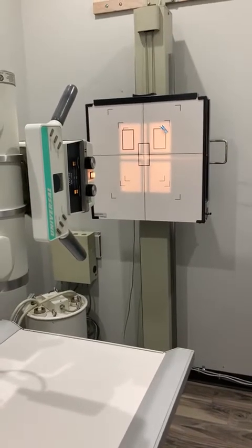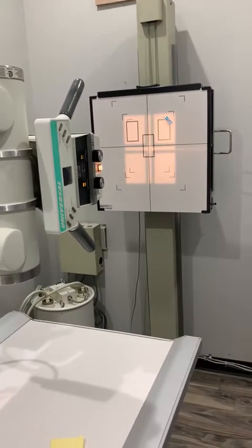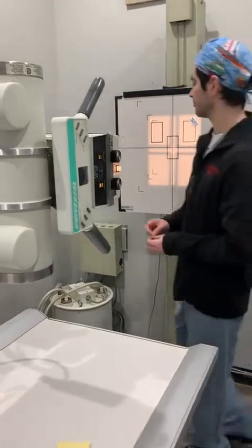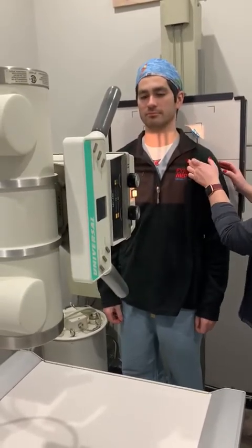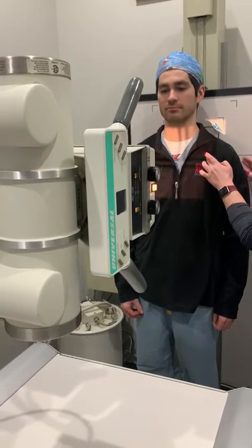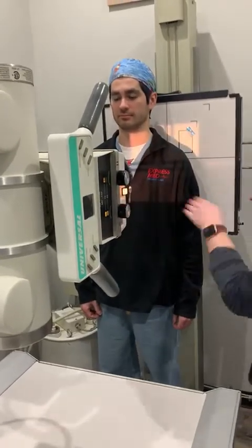We're going to do a simple shoulder X-ray. You're going to have your tube at 40 inches, perpendicular to the bucky. It's going to be a small film. You're going to have your patient with their back up against the board, right into their shoulder joint. The central point is going to be pretty much into the middle of their joint. Step off to the side, right about there — perfect.